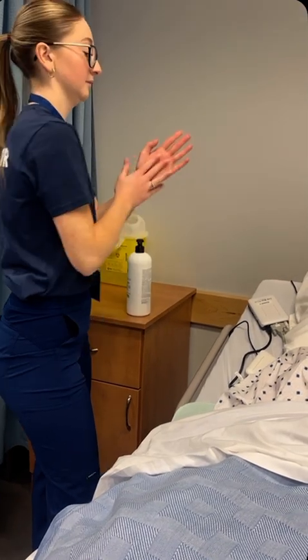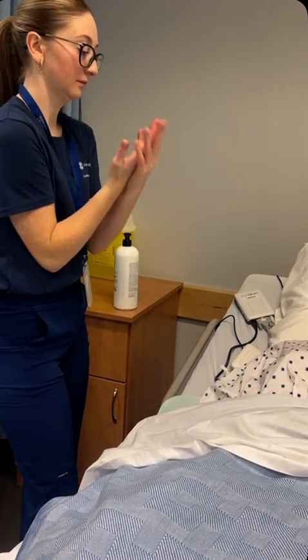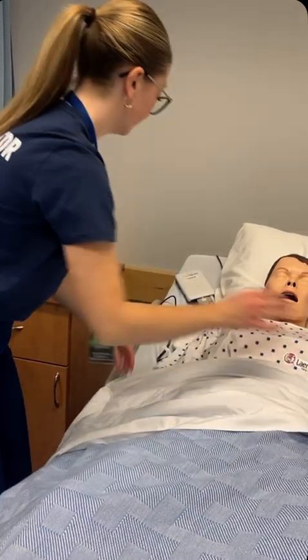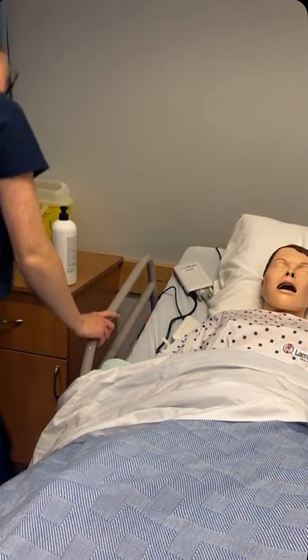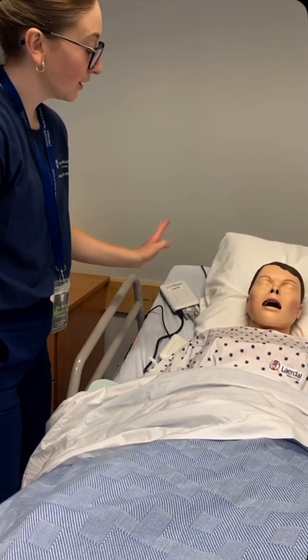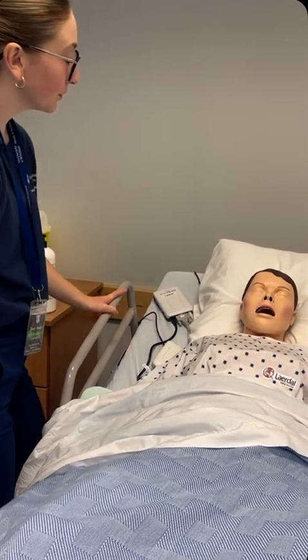Performs hand hygiene and labels specimen if required. Repositions the patient and client for comfort and performs safety checks and asks patient and client if they have any questions before leaving the room. Do you have any questions for me before I leave the room?